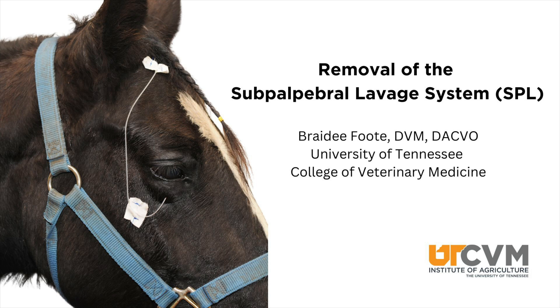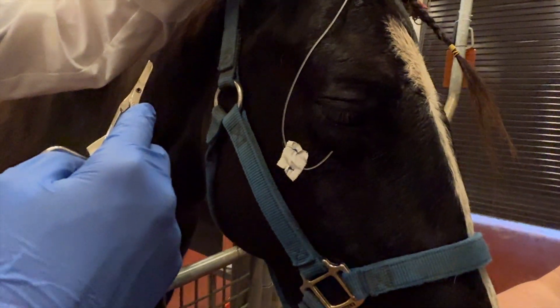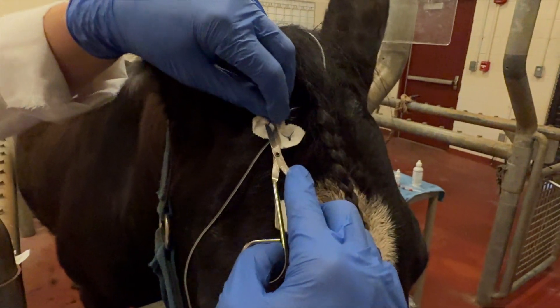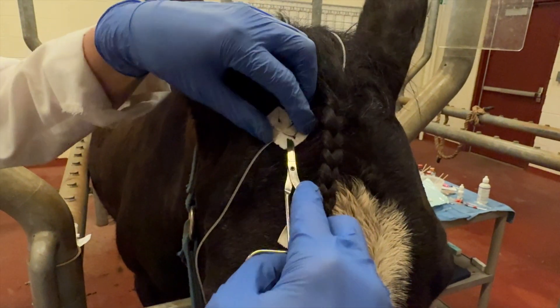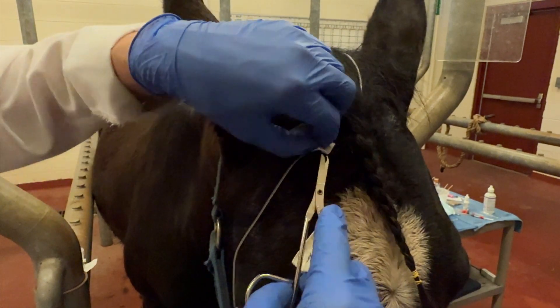This is a demonstration of a subpalpebral lavage system removal. The lavage system can stay in place for weeks or months as long as there are no complications and it is functioning. The lavage system is eventually removed once the eye no longer needs medications.